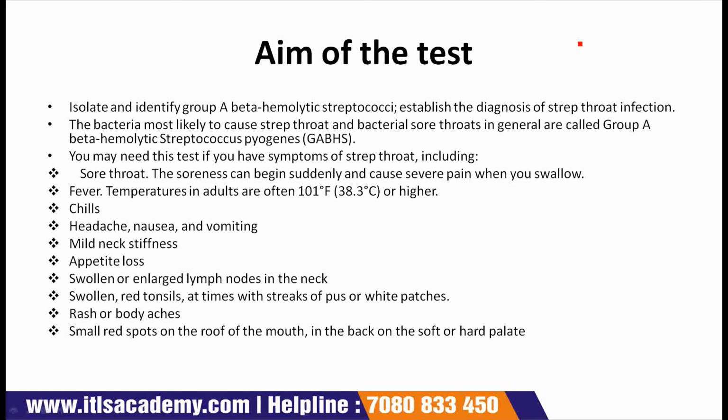Aim of the test. The aim of the test is to isolate and identify group A beta-hemolytic streptococci, and establish the diagnosis of Streptococcus throat infection.